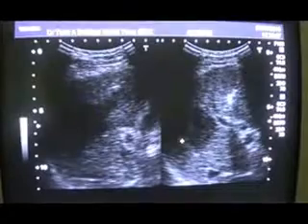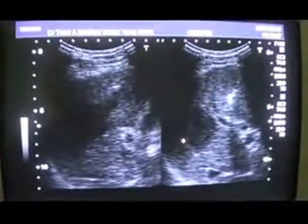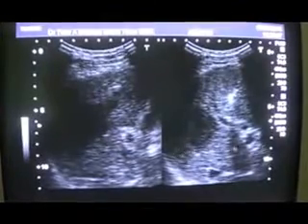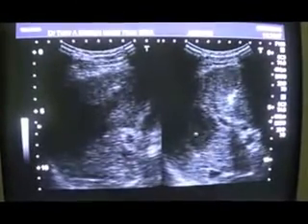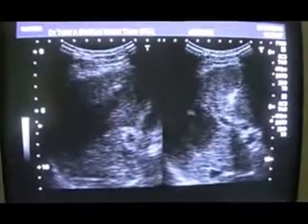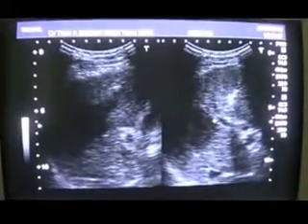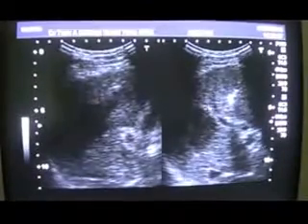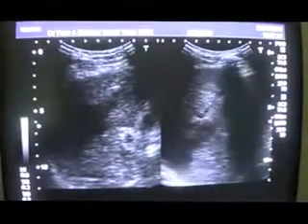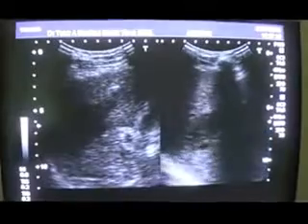So this is something of interest that one may not label as an aggressive pathology, though we do not see any posterior wall enhancement from it, and it is not an abscess because it changes its shape. It's not a cystic mass. It's not an aggressive lesion, because had it been an aggressive lesion, it would not have changed its shape. So here I'm going to do it again for you. Here you see again it changes its shape.